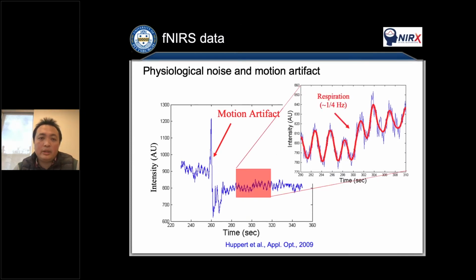You can also see respiration at about 0.25 or 0.3 Hertz, and also blood pressure, or this is very low, around 0.1 Hertz frequency. So if you see this, the physiological noise can be misinterpreted as brain activity and can drive both false positive and false negative estimates. This error is particularly troublesome when there is a possible task-induced systemic change in the signal.